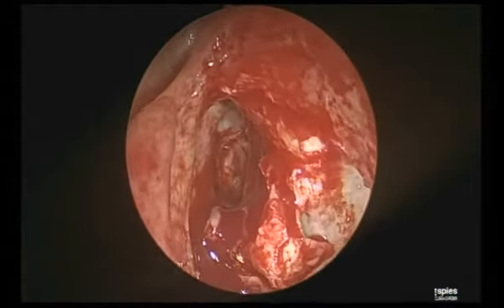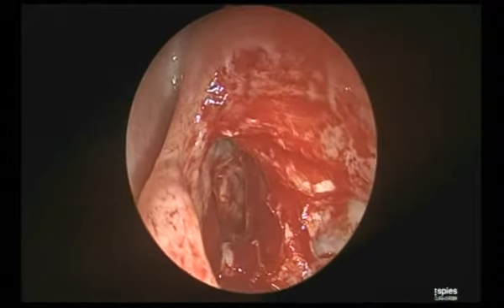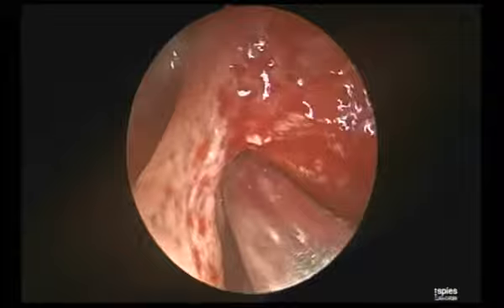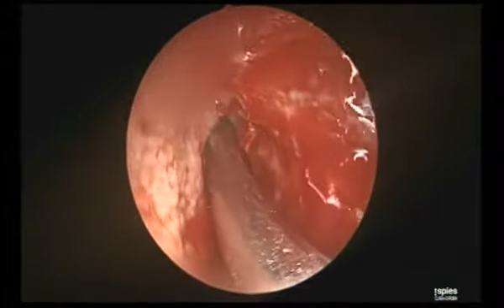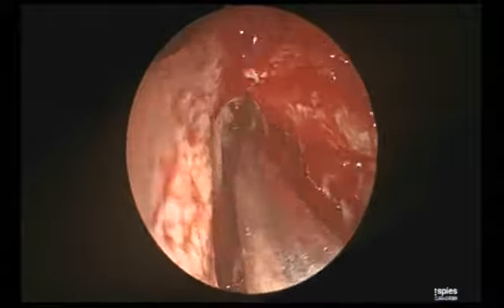I have done a 19th revision of a patient, operated so many times everywhere in the country, but this region is always intact. And this single landmark can take you to the frontal easily. Can you see this? If you follow the beak, you cannot go anywhere else. You will go directly into the frontal if you follow it behind.